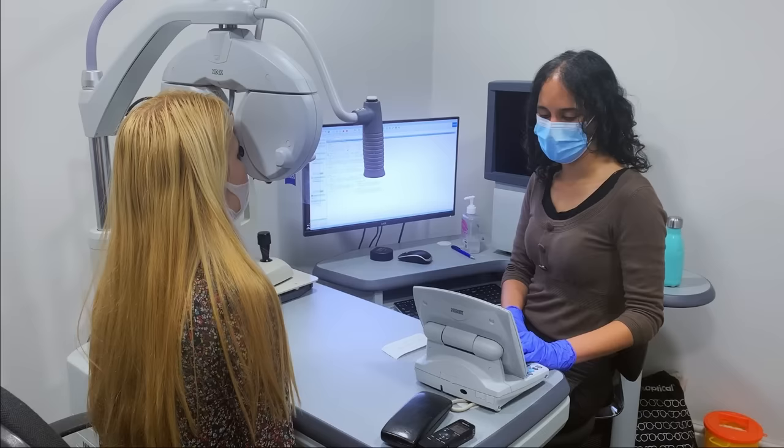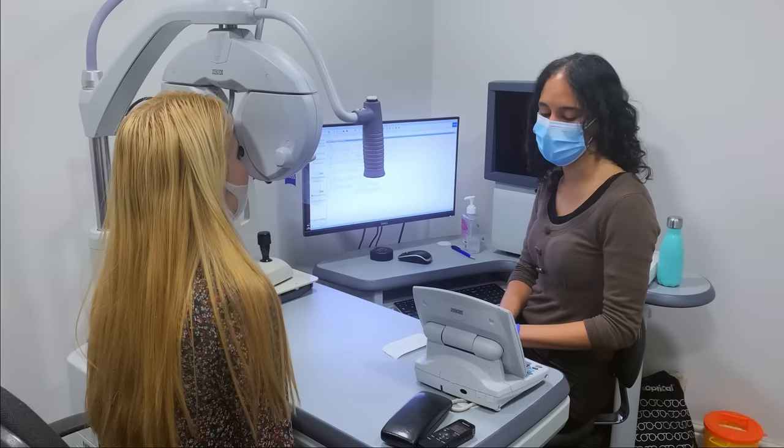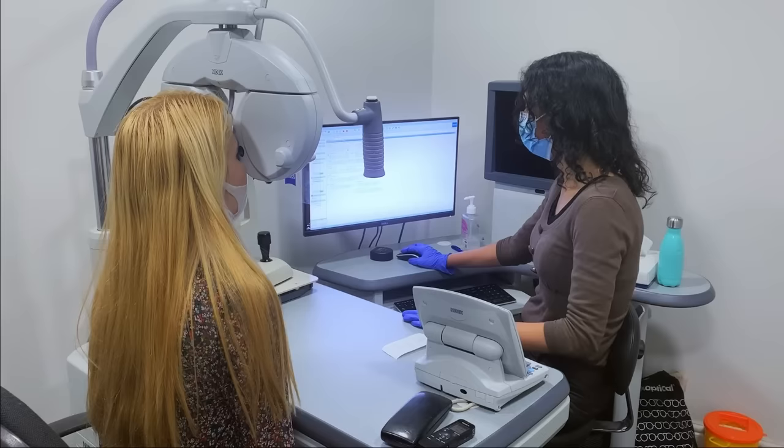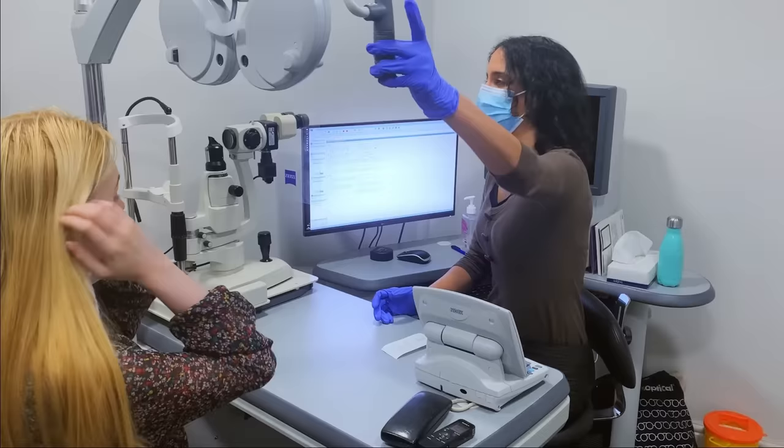Okay, good, excellent. And could you make out any of the bottom line now? Possibly. It is very tiny, so don't worry if you can't. I think the first one's either an H or an N. Good, excellent. R, K, C, or G. Very good, excellent. Lovely, thank you. Thank you, Melissa. You can sit back now, brilliant. Okay, let's take this away.